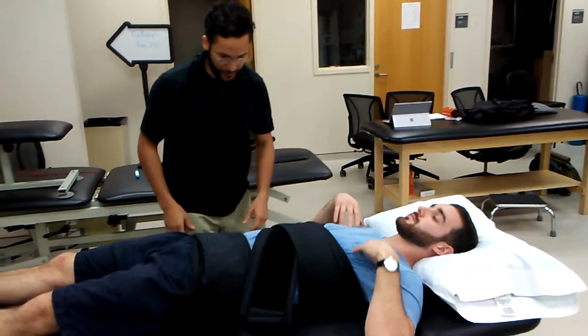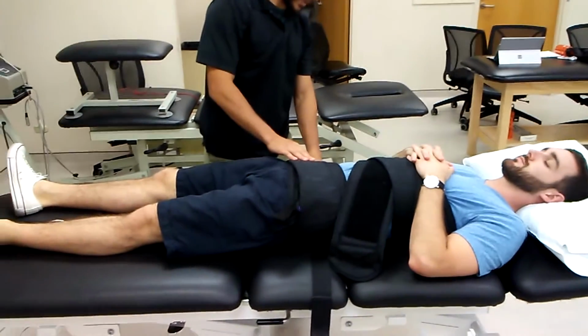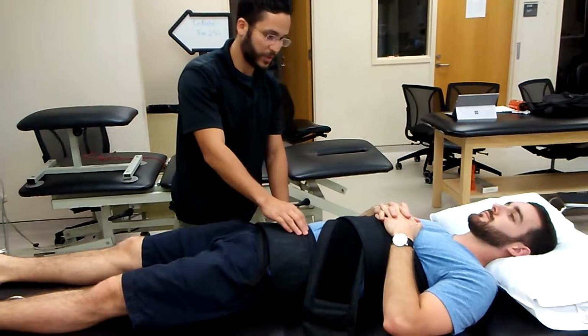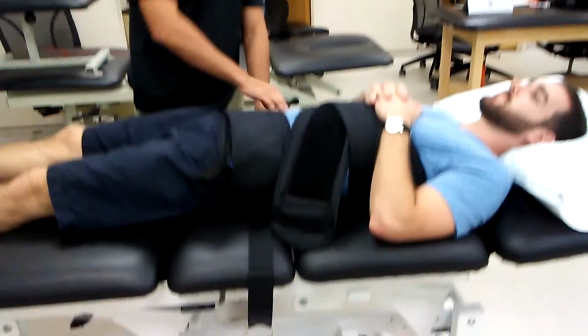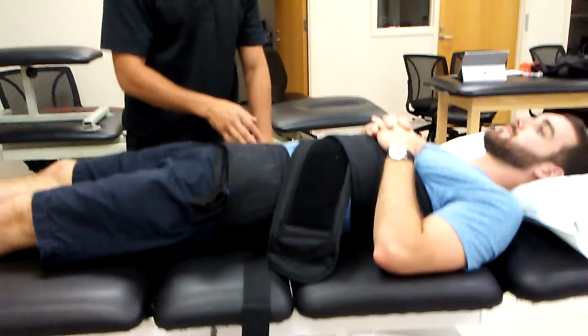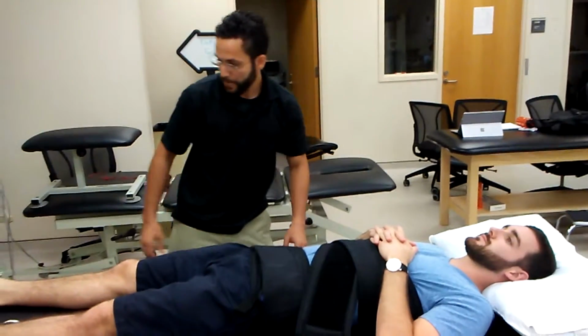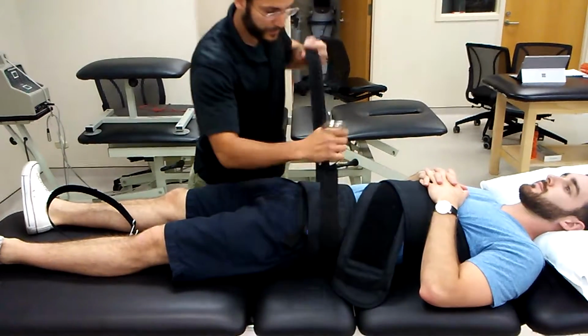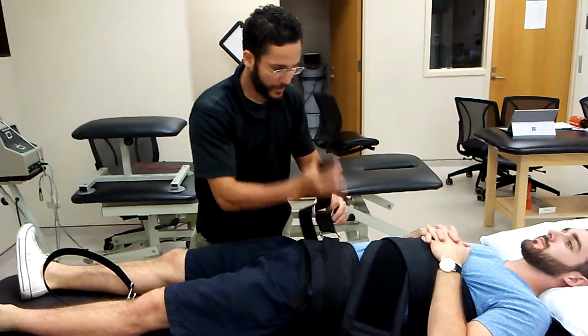Perfect. Perfect. So I want to make sure just beforehand that his body's between the opening space for the table, which it is. Since it's just muscle spasms, we're going to be just generalizing the posterior musculature of the back. Right, next I'm going to tighten the belt.